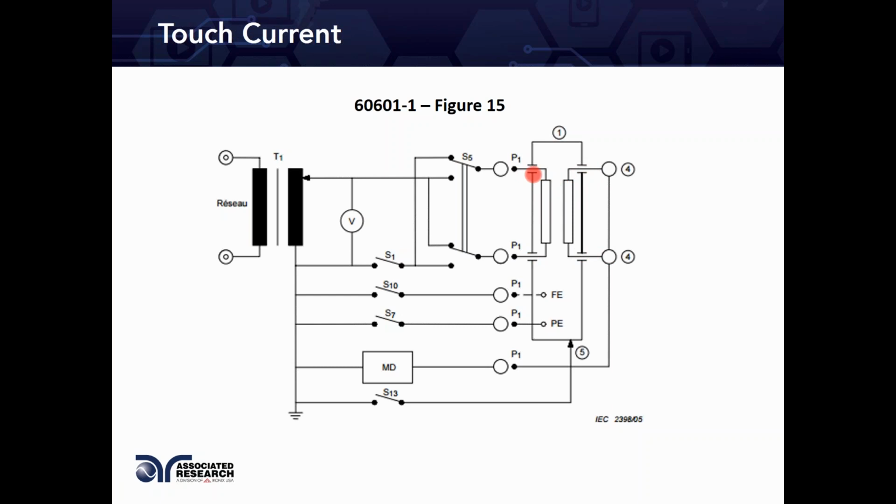So depending on what kind of power supply you buy, it either really isolates your outputs, which are applied parts, SIP-SOP connections, any chassis points, or buying mediocre power supplies would create issues for you passing this auxiliary or patient leakage test, due to the nature of a leaky power supply to ground creating flow towards the applied part and back through the measuring device to the neutral side.